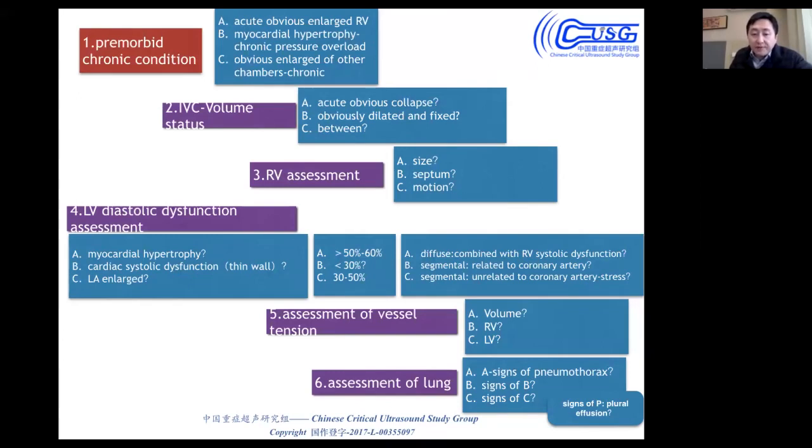And the fifth step will assess the vasotension and the volume; the RV function and the LV function should be taken into consideration to assess the vasotension of the patient.